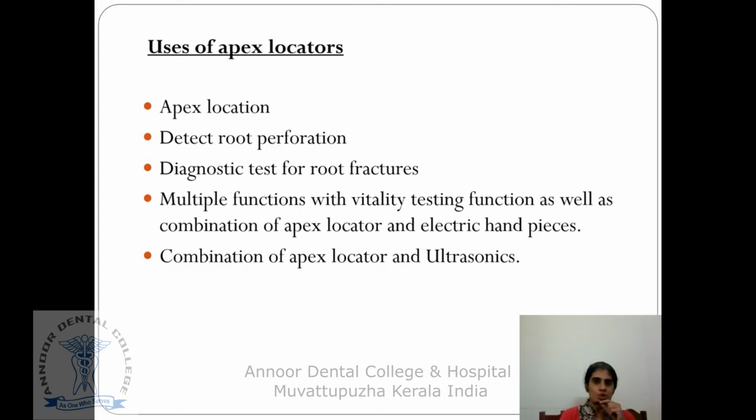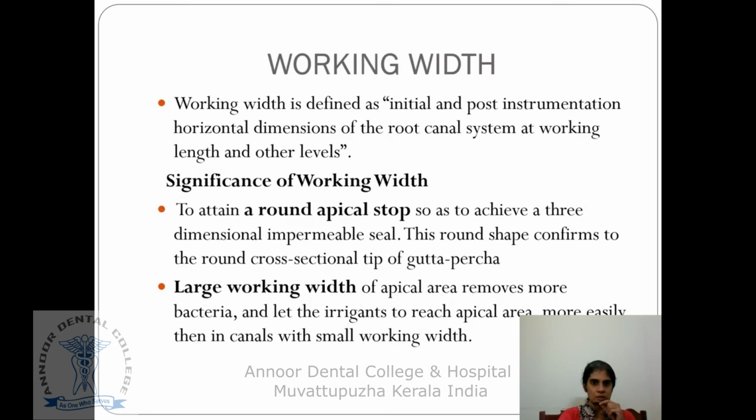Next, we will see the uses of an apex locator. It helps in easy location of the apex, it can detect root perforations, and it can diagnose root fracture. And as we saw earlier, some function as both an endodontic electric handpiece and an apex locator, and some function even as a vitality testing machine as well. There are also combinations of apex locators and ultrasonics. These are the different applications of apex locators.